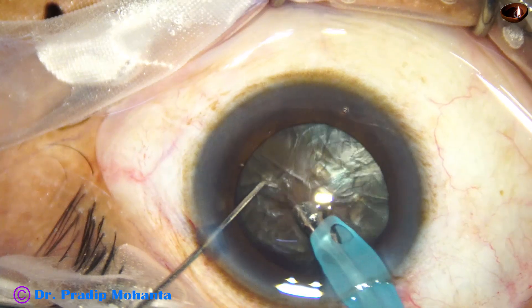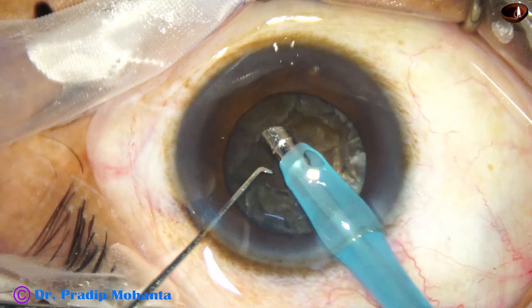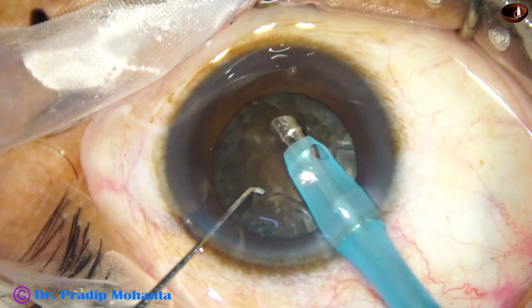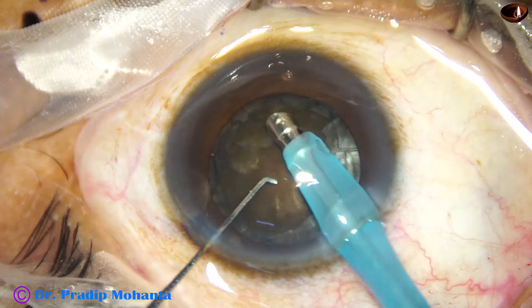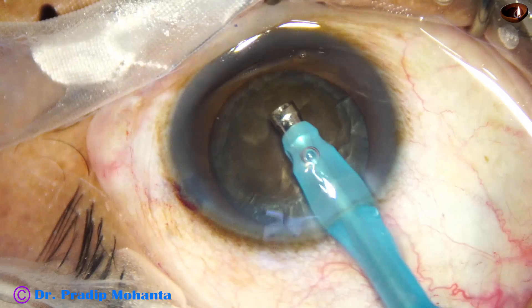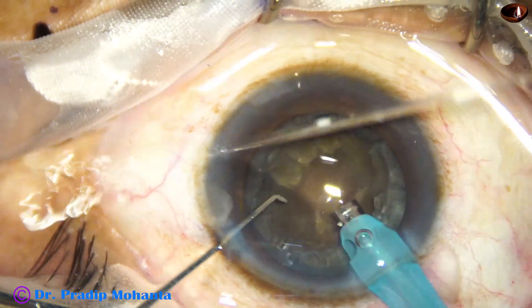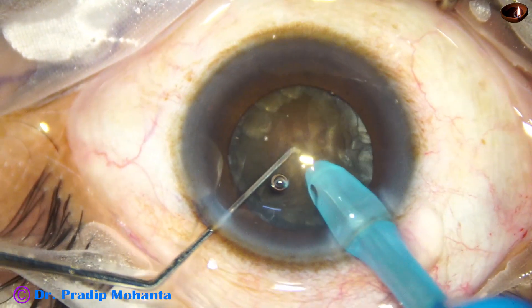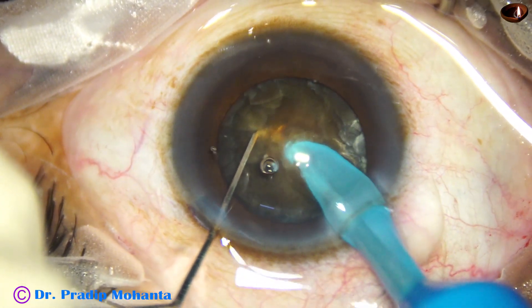And now I am going to do the submarine job. This part of the video — the nucleus management part — is unedited and real time. Some superficial cortical lens matter is being removed by the FACO needle with its bevel down. Now I turn the handpiece and make the bevel up — watch the submarine job. The tip is buried just in front of the main wound and then the tip travels through the substance of the nucleus, as the submarine moves through water.